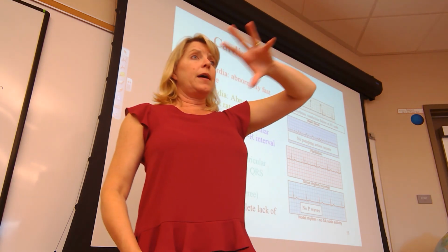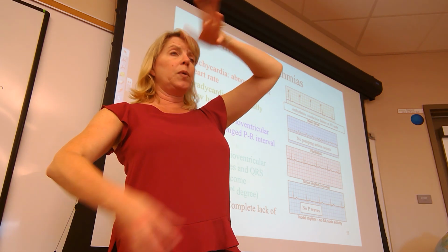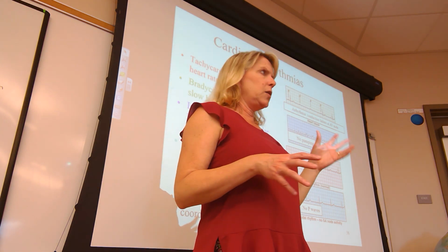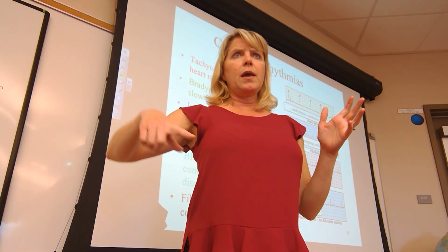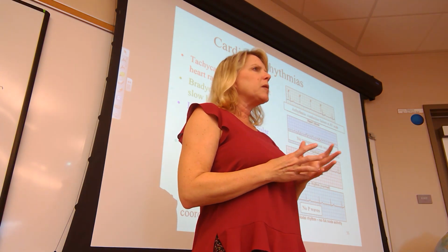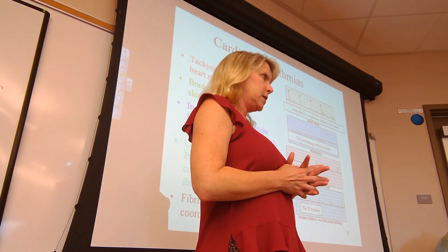When the atria and the ventricles are completely dissociated, when they do not have syncytium, then that's considered third degree AV nodal block. You would see a P wave after P wave after P wave, and then a QRST. I'll remind you of the perverted experiments that I did as a graduate student.